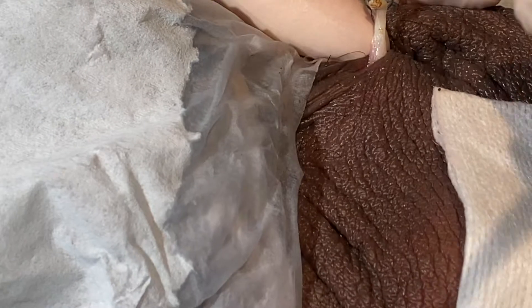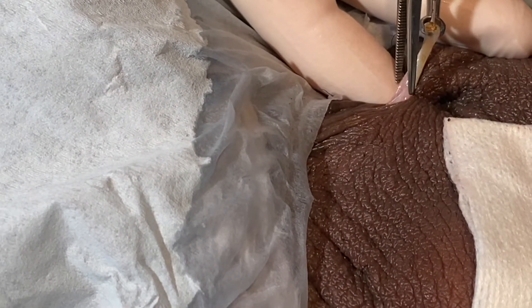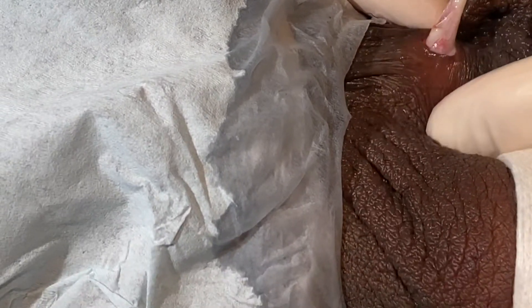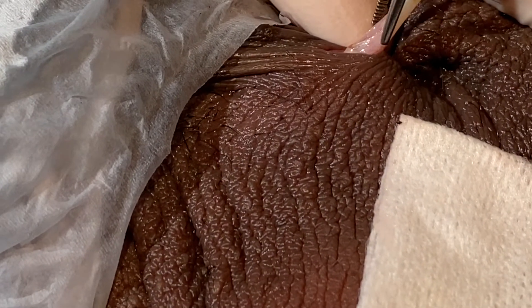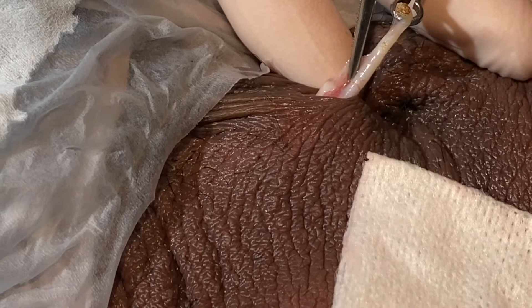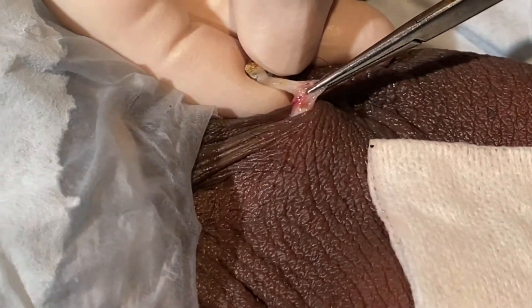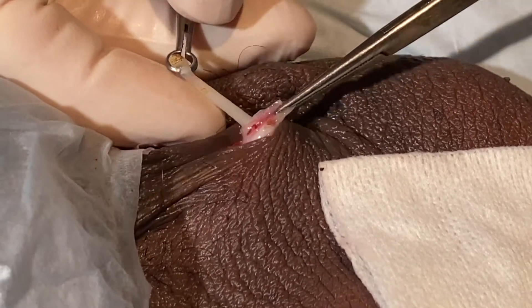This is not a good demonstration of an individual with a clingy sheath — he has a nice loose sheath. It's easy to bring up. You can see the two layers — the anterior sheath and the posterior wall of the sheath. Now I'm just bringing those together and then rotating back like this.